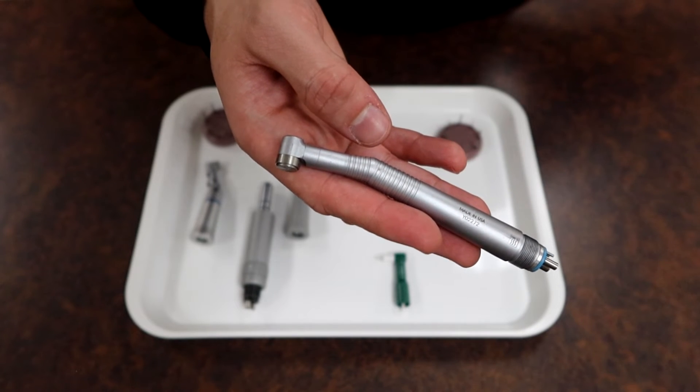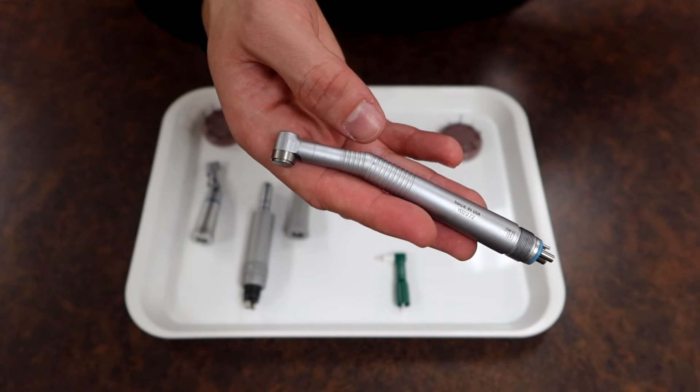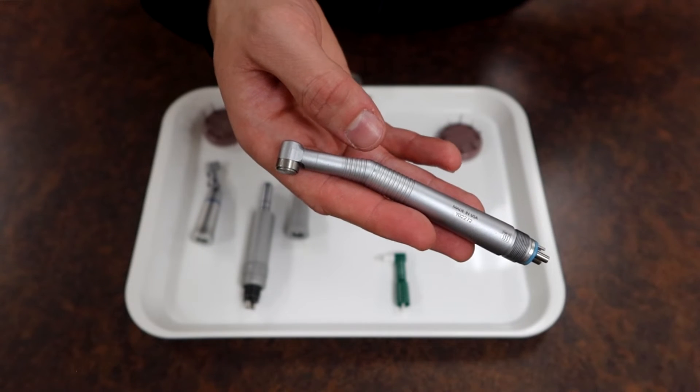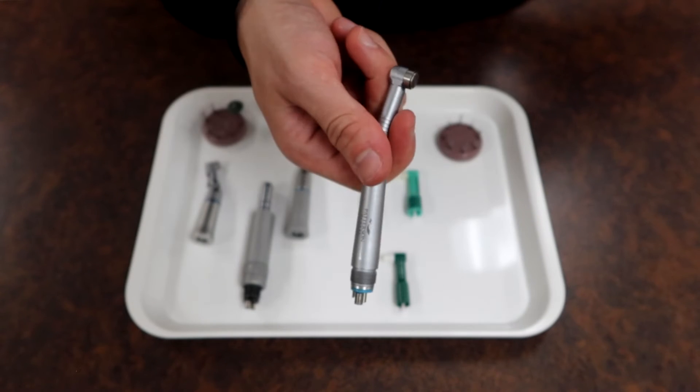The high speed handpiece is used to remove decay, cut teeth, prepare teeth, adjust crowns and occlusions, and much more. This is only operated by the doctor — though assistants may sometimes use it when trimming crowns for temporary crown placement, but never on a patient. It is specifically the doctor's tool of choice.